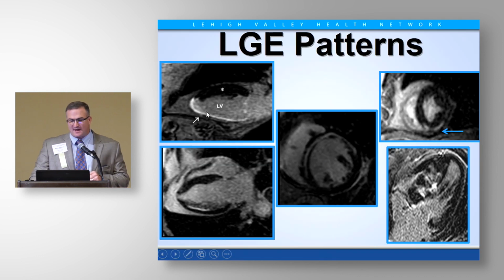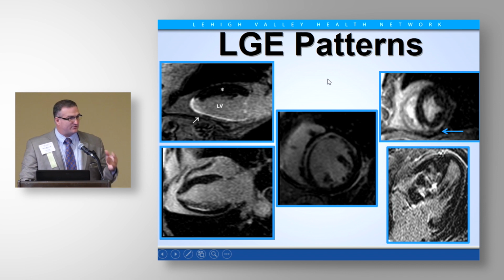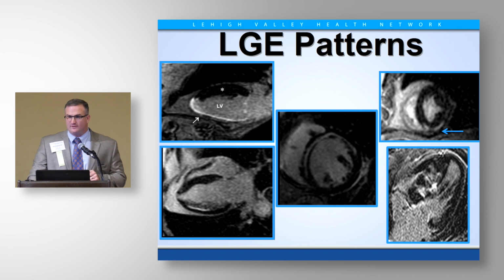And we see this pattern, and it helps us better identify, is it an infarct, or is it HCM, or is it myocarditis? Obviously, this is going to help you with diagnosis, but it's certainly going to help you with management of that person as well. So it's not just the presence, but the pattern that helps you identify and manage the folks with a cardiac MR.